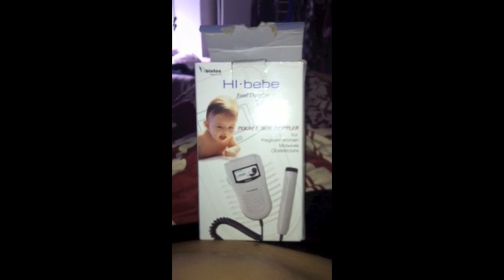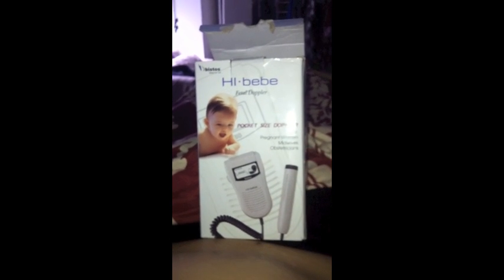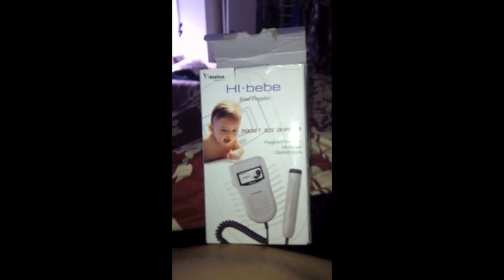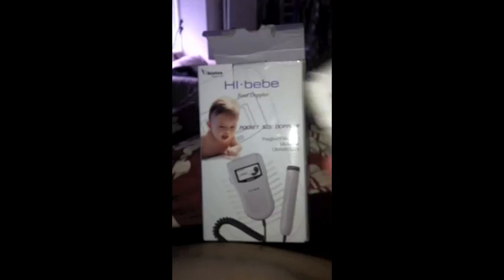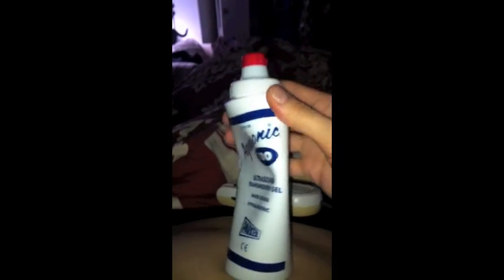This is my fetal monitor, it's called Hi Baby, and I believe it's 2 MHz. And this is it right here. It came with its own ultrasound gel, but I actually used it all — kinda crazy. But it also came with an extra bottle. It was about $75, and I got it on a website online.